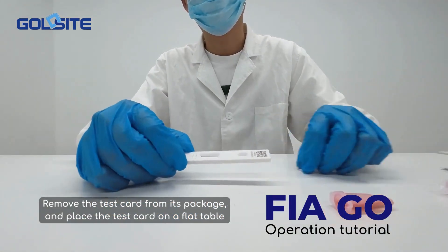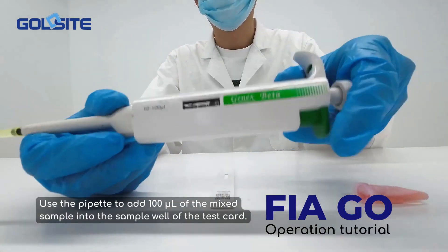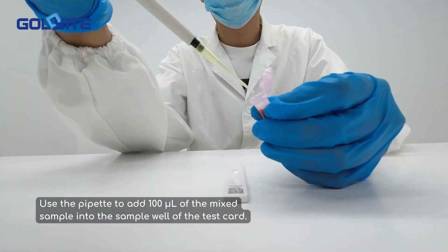Remove the test card from its package and place the test card on a flat table. Use the pipette to add 100 microliters of the mixed sample into the sample well of the test card.